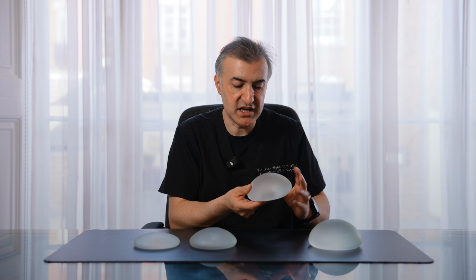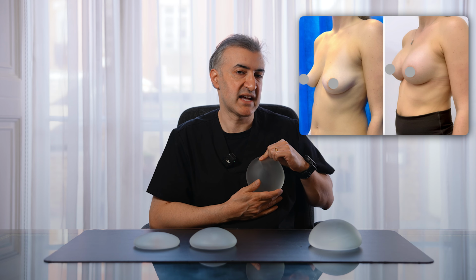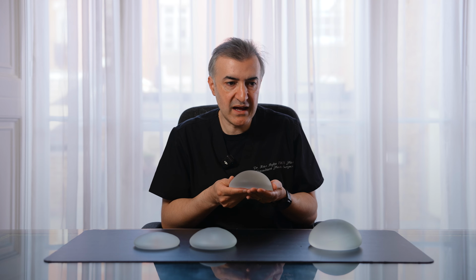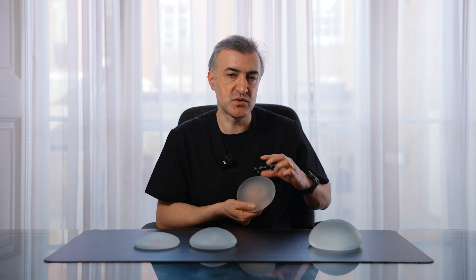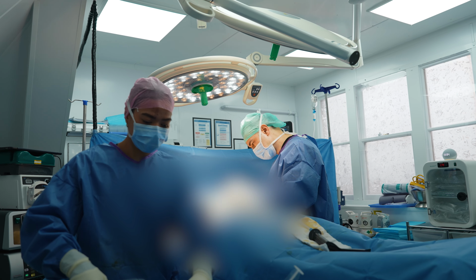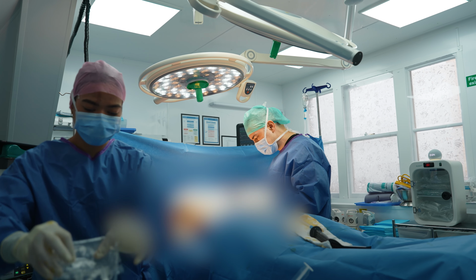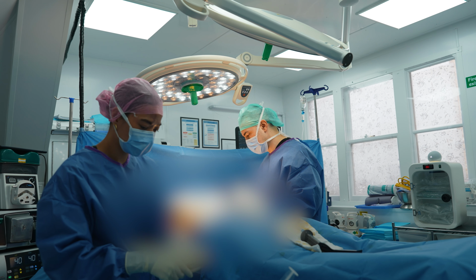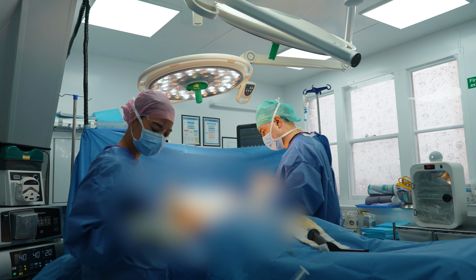If you go on to the full projection, this will be where somebody's looking for, say, a 3-cup increase, something like that, just speaking approximately. You're going to have enough volume of soft tissue to accommodate a full projection. One disadvantage is, of course, that you're now getting heavier, and as you get heavier, there's going to be pressure on the lower pole, and that can make it stretch over time. There are certain techniques that we can do to try and reinforce the lower pole, to give more resistance to that stretch. But if somebody has very thin skin and thin soft tissues, there's going to be a degree of instability there over time. Very important that you wear a bra to support the breasts.